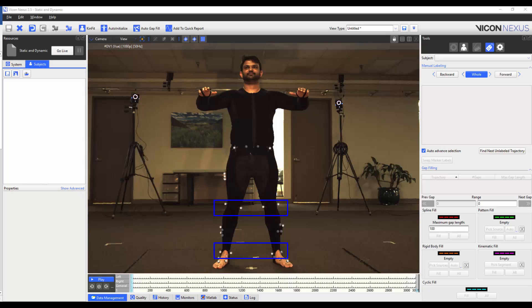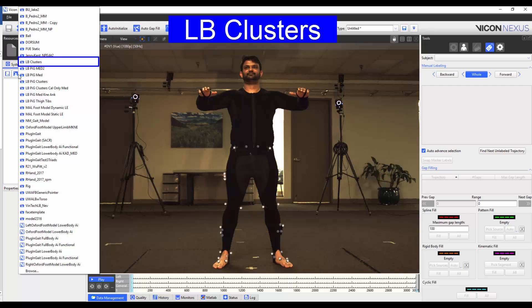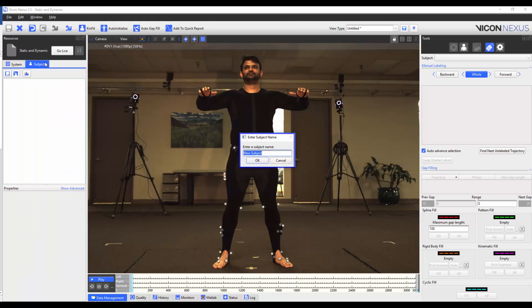We've also placed calibration only markers onto the knee and ankle joints. I'm now going to load the VST that we made in the previous video by going to the resources pane, subjects tab, and I'm going to press the middle button called 'create a new subject from a labelling skeleton.' From this list I will select the VST called LB clusters, and to finish I'm going to give my subject a name.